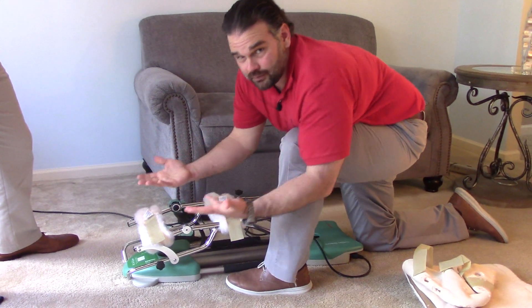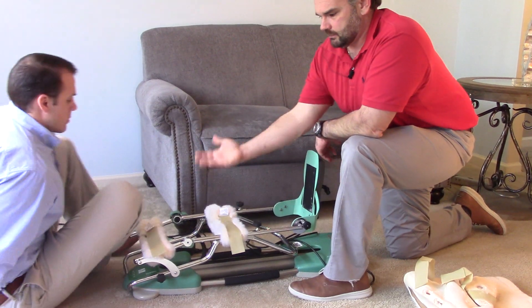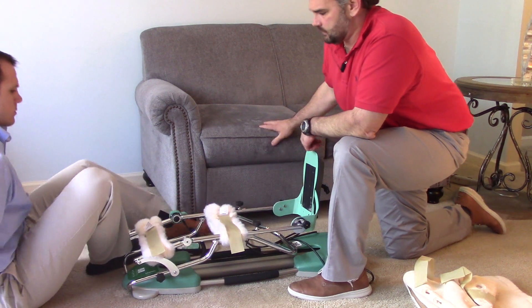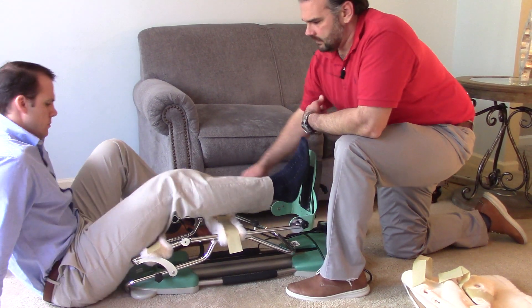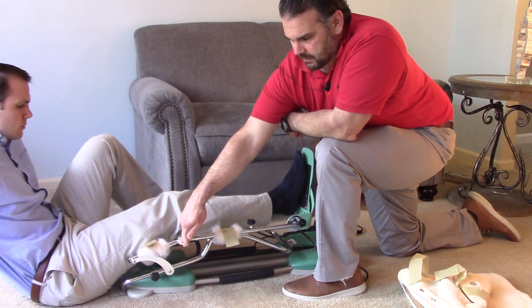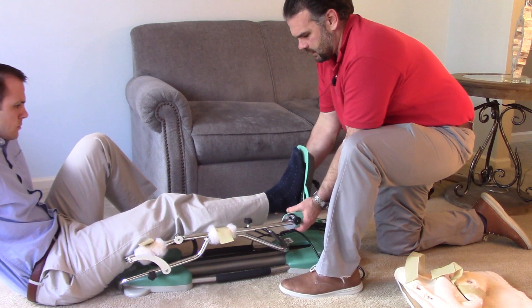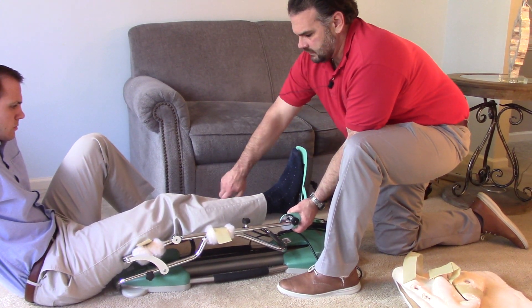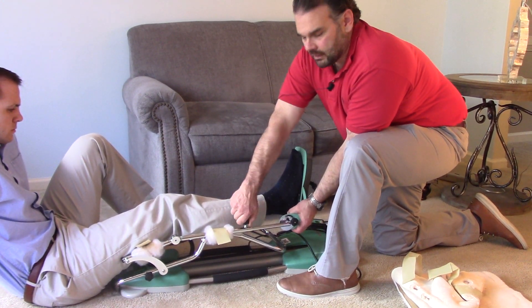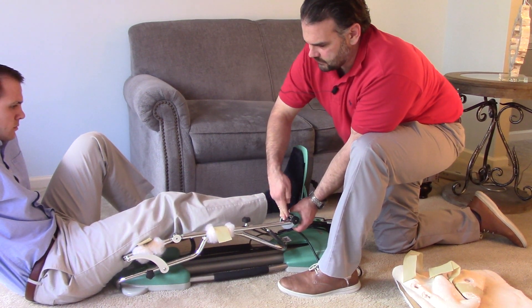Obviously you're going to need another person to help you with this. You'll sit down into the CPM, as Russ is doing, and your knee should line up with this fulcrum, because that's where it's going to bend. Then we'll bring this back to the bottom of the foot and tighten these down, and that's how we get the length right from the knee to the bottom of the foot.